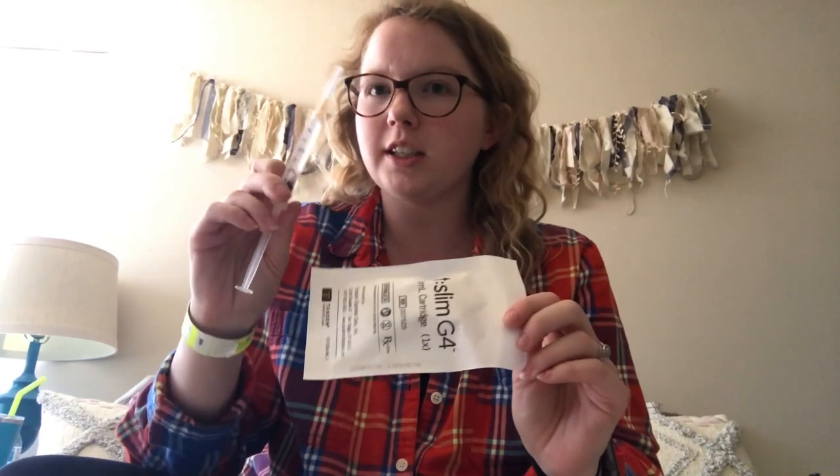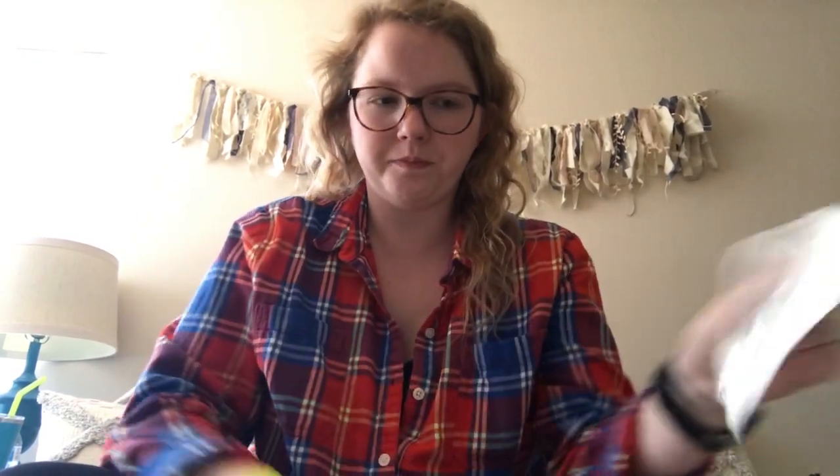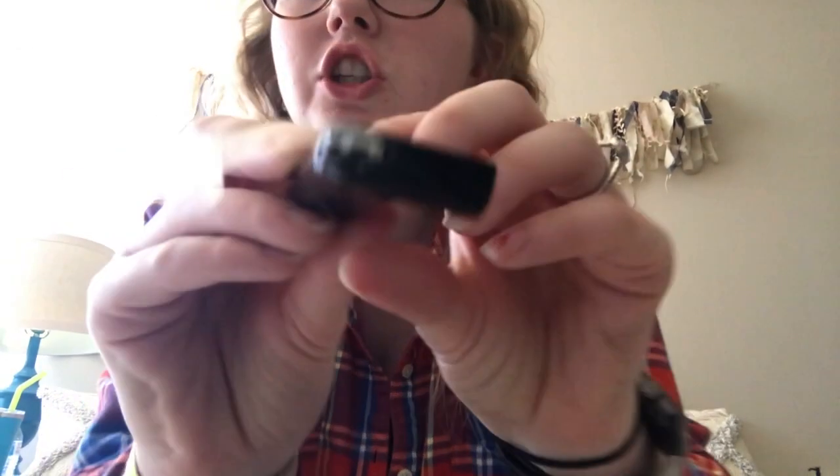This is the t:slim 3 mL cartridge — all of this insulin can only fit in here. I'm going to open that up and there's a little white stopper right there — a little rubber stopper.